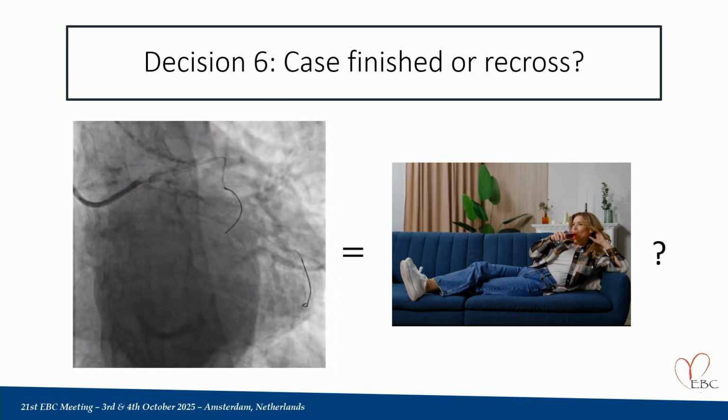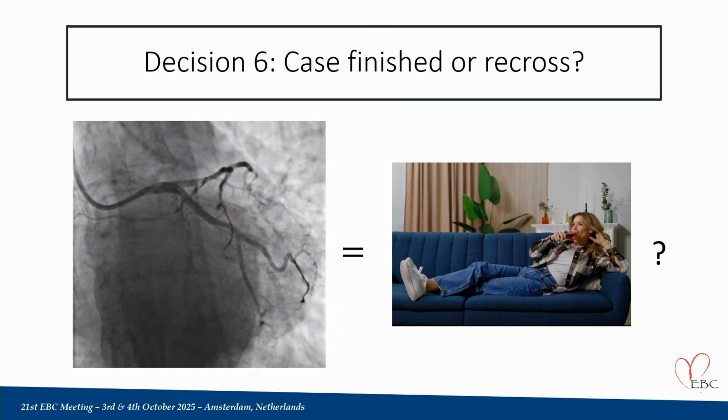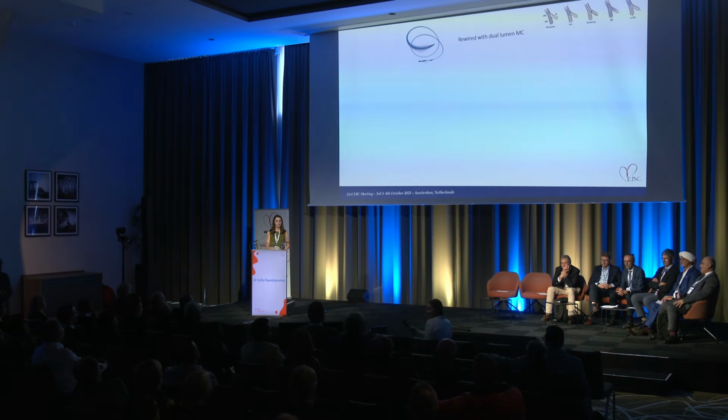So that's the result. Is the case finished? Can I see a show of hands? Who would stop at this stage? No one? Everyone would recross? That's what we did. Would your opinion change if I said that there was a start time of 9:20 and we're already 2 hours into the case? No, still recrossing. So that's what we did.